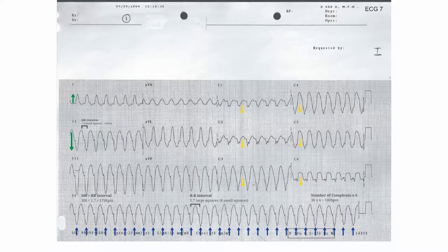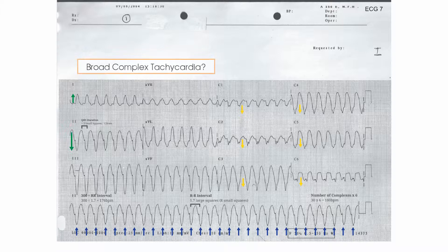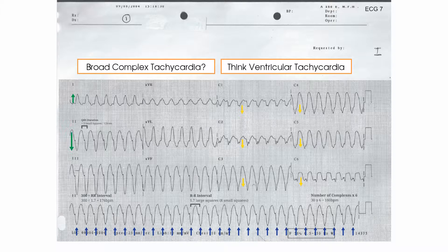Ventricular tachycardia is often taught in the context of the single lead appearance in a shockable arrest rhythm. The clinical status of the patient is not able to tell you that the patient does not have ventricular tachycardia. To reiterate for the final time, broad complex tachycardia should be thought of as ventricular tachycardia until good evidence is found otherwise. Seek help from someone who can help you to make this decision.